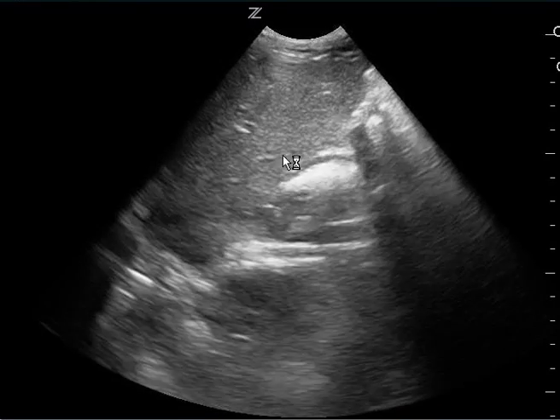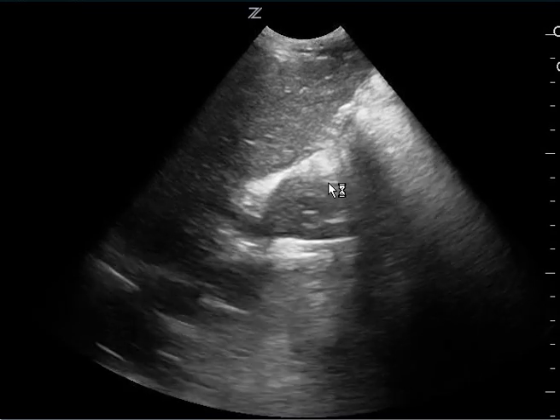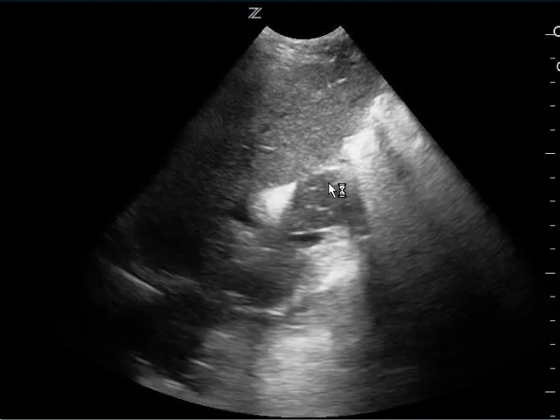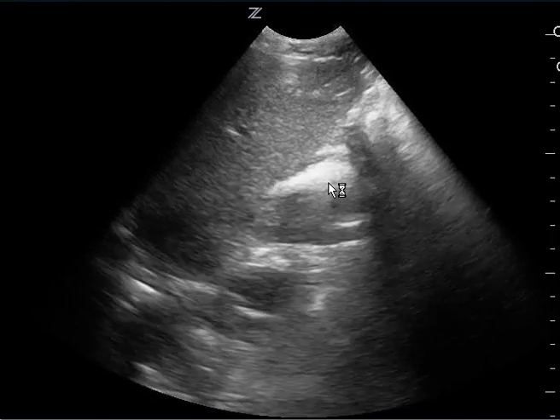This is a FAST exam. This is the right upper quadrant. You can see the liver here. I don't see the kidney too well, and so it's hard to get a good look at Morrison's pouch since the interface between the liver and kidney isn't there. It's also difficult to see the inferior pole of the kidney.